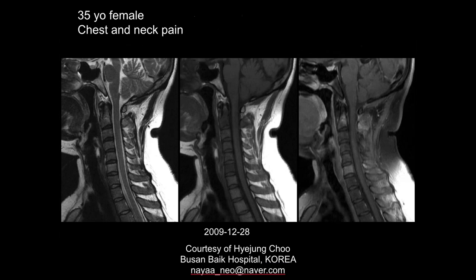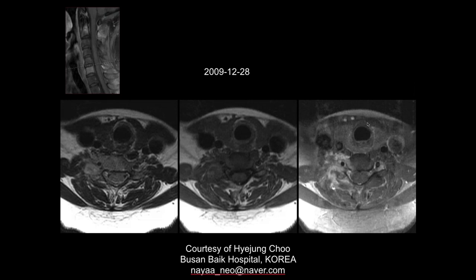35-year-old female with chest and neck pain. There is edema at the C6 vertebral body and possibly at C2, with enhancement involving the posterior elements and edema in the perivertebral soft tissues. The appearance is consistent with inflammatory arthropathy.